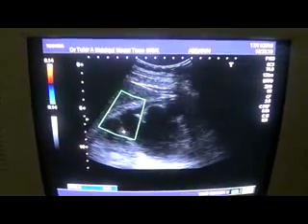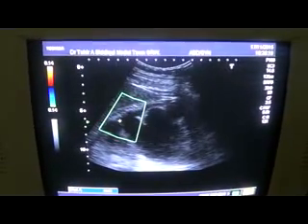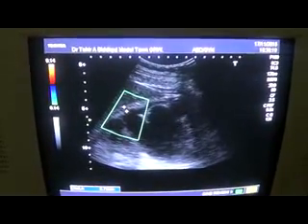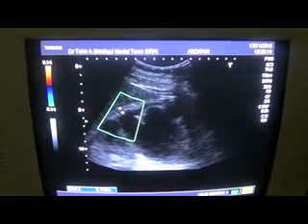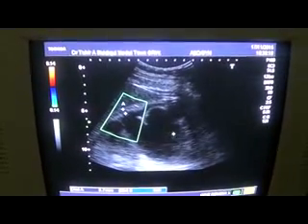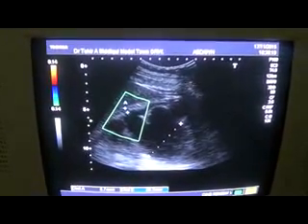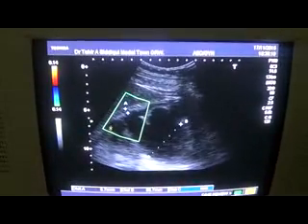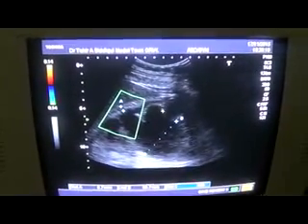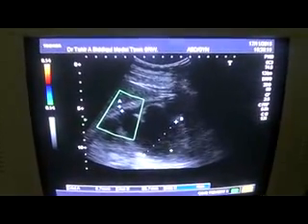Now you see that the hydronephrosis is to the extent that it has compromised the parenchyma of the kidney. The parenchyma measures only 5.7 millimeters, and there is debris within the dilated pelvis of the kidney. This is the pelvis of the kidney, in fact. So this is the upper pole, this is the mid region. In this view you are not seeing the lower pole. However, the pelvis, filled with debris, is clearly seen.